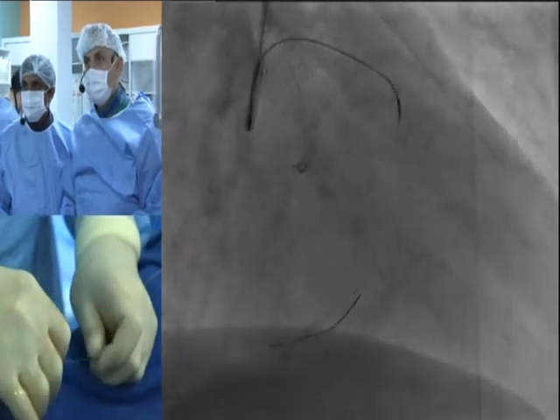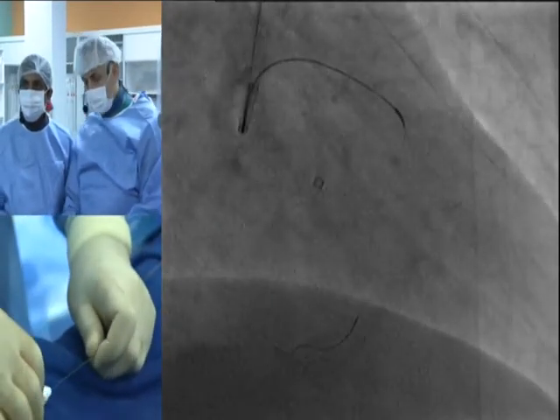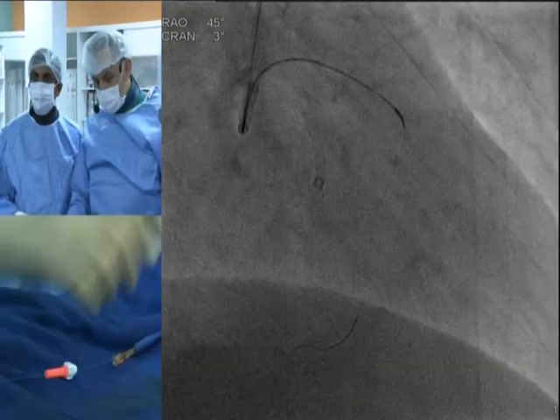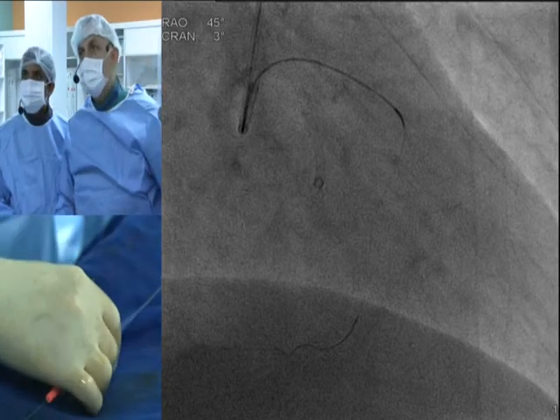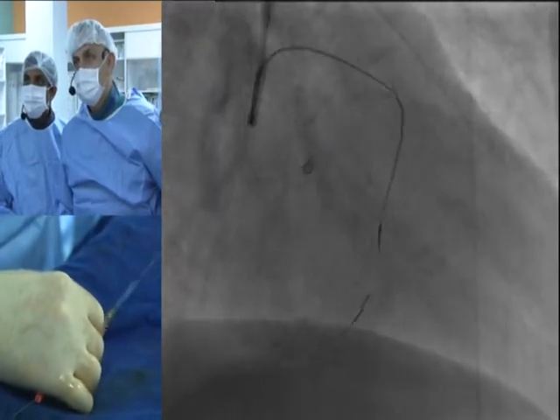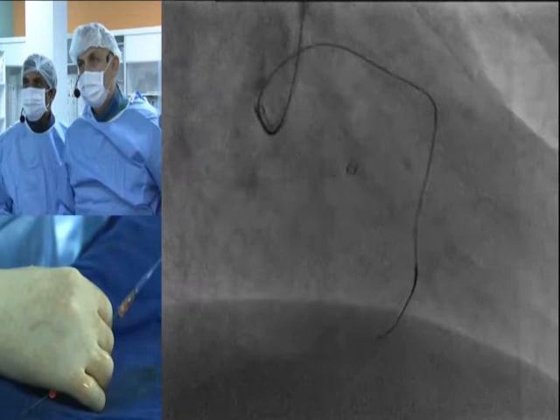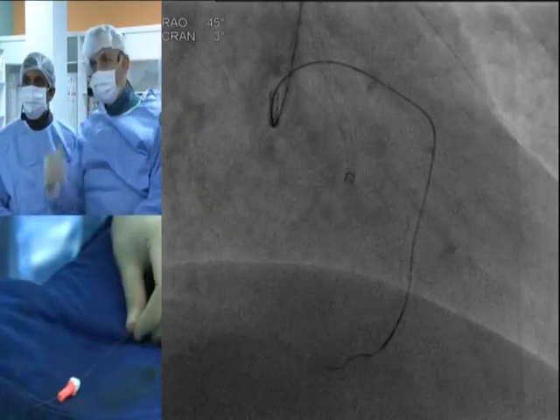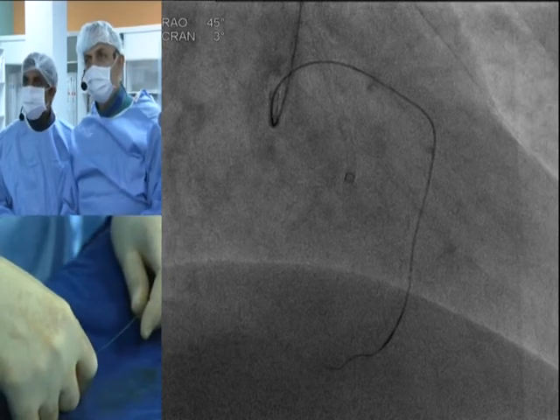So see the beautiful technique of advancing the Sion. We actually go somewhere. And now you should see how the Corsair is being advanced slowly. And then if we go to the left now, try to go a little bit higher.